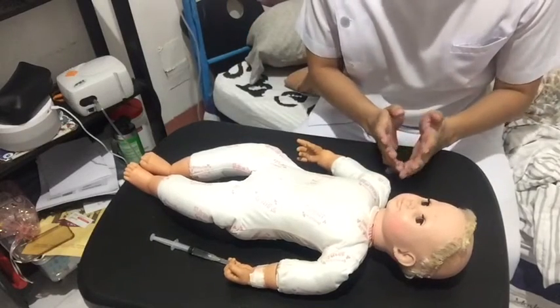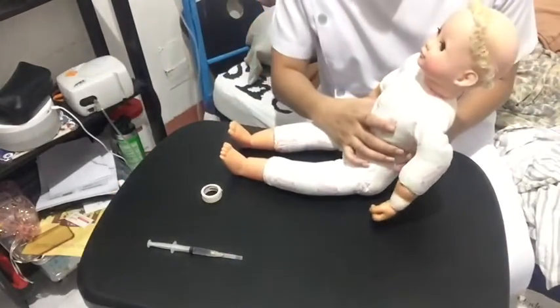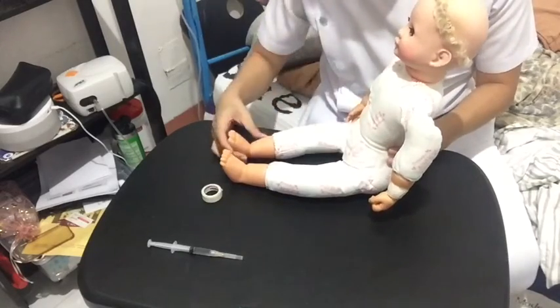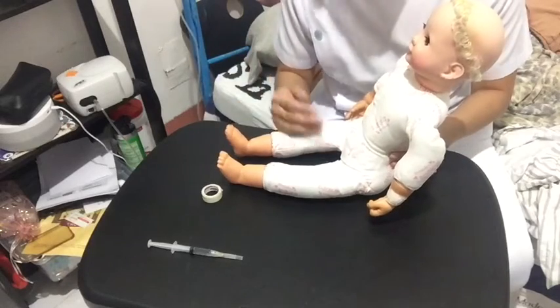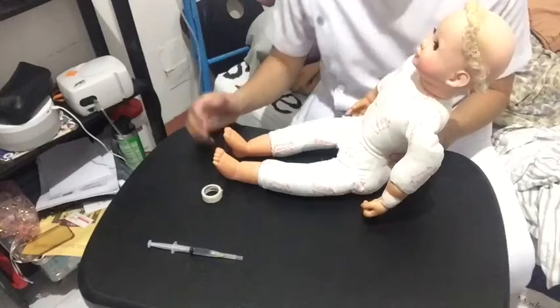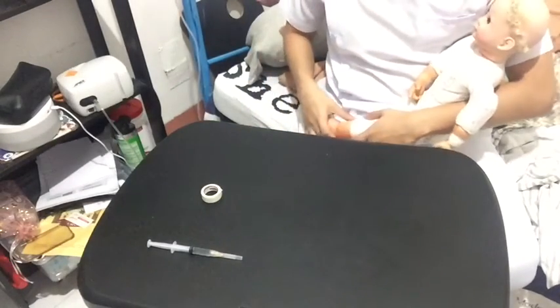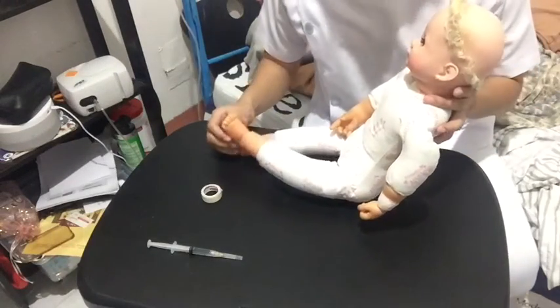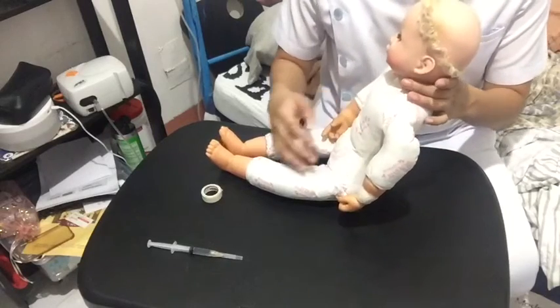Now, on the next procedure, we're going to be placing the client in a seated position, more preferably a semi-Fowler's position. But since this is a baby, we can assist the baby through this position. The purpose of this is to help with lung expansion, because when seated the lungs can function properly.